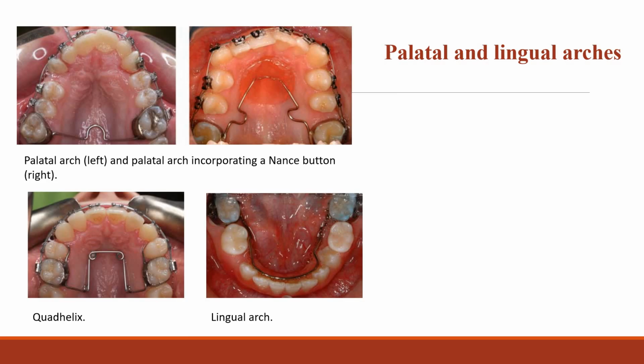An impression is taken with the bands inside, and they are transferred with the impression to be cast up on the working model by the technician, who then constructs the relevant arch. The appliance is then cemented into place within the mouth.